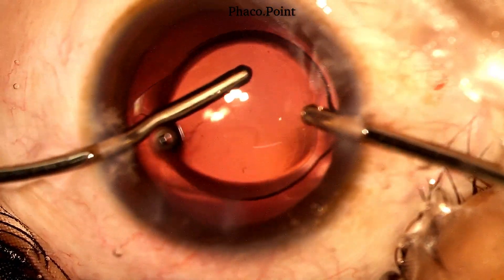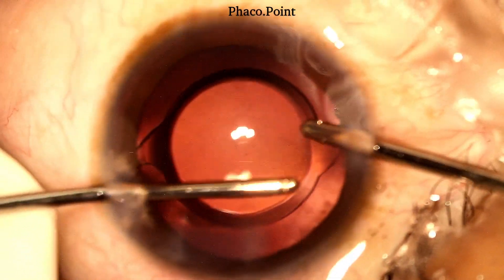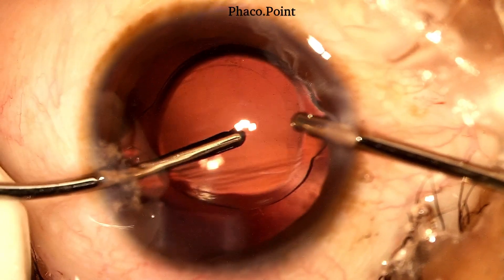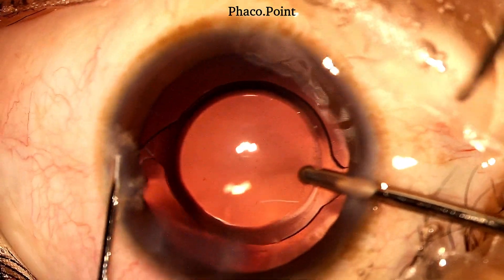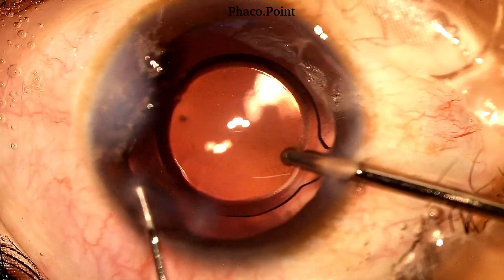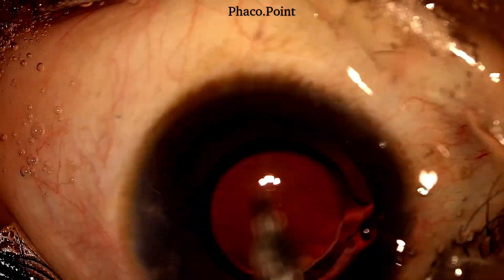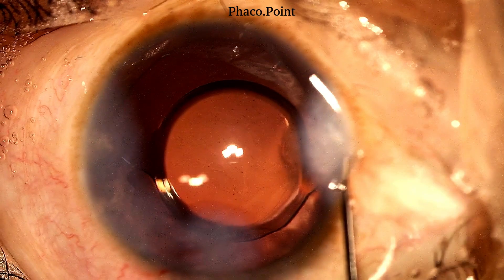No excessive movements of the IOL are performed because this is a patient with a polar cataract. Following the completion of the visco wash, the aspiration cannula is removed from the eye, and whilst maintaining the irrigation in the eye, the two incisions are hydrated. Upon completion of their hydration, the source of irrigation is finally removed and the paracentesis incision hydrated.